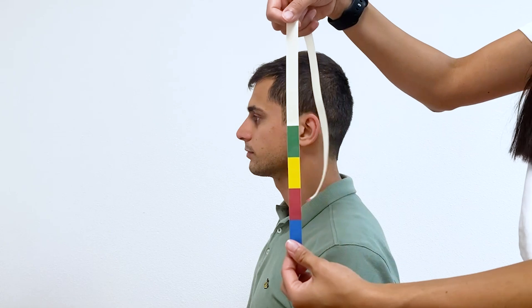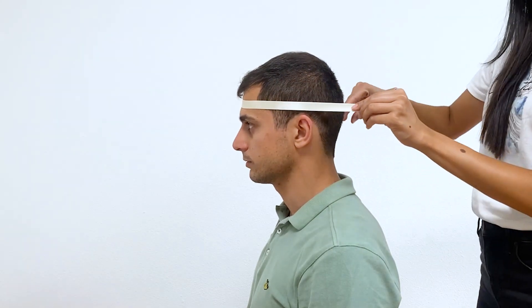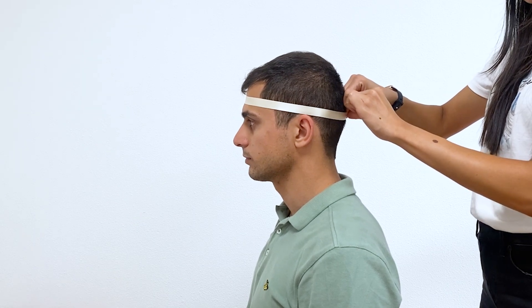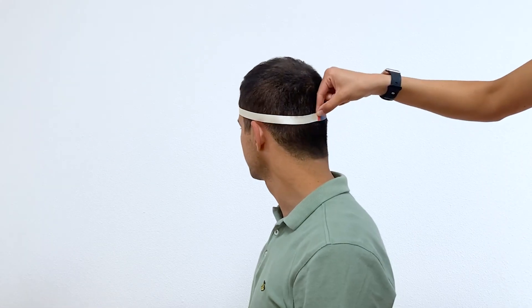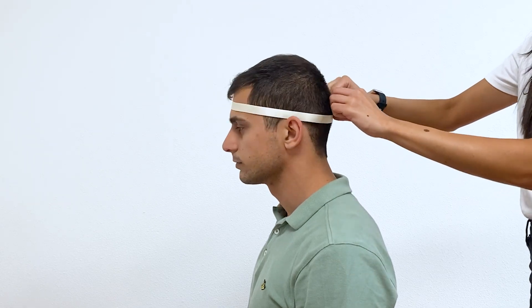First, grab a tape measure in centimeters or use TMSI's color-coded head measuring tape. Use either measuring tape to measure the participant's head circumference by placing the tape around the widest part of the head from the forehead to the occipital bone. This will give you the measurement in centimeters or a color that will correspond to TMSI's head cap sizes.